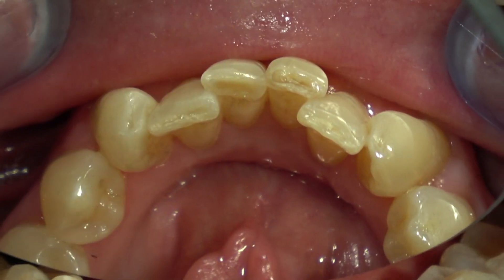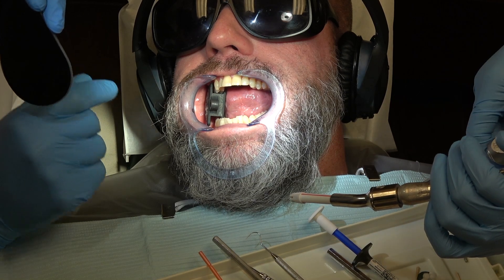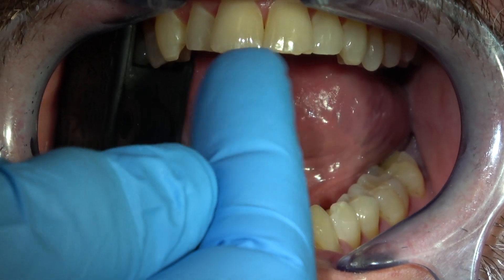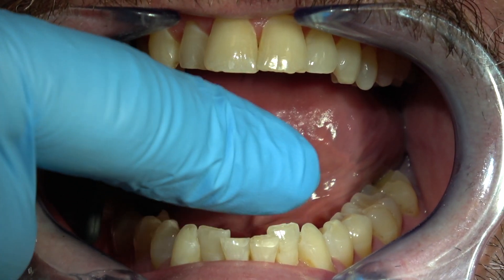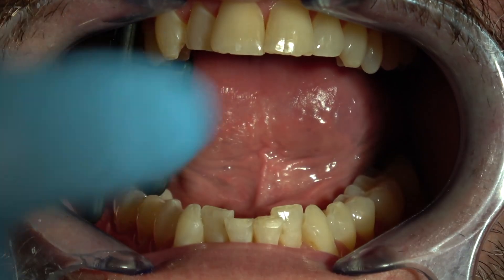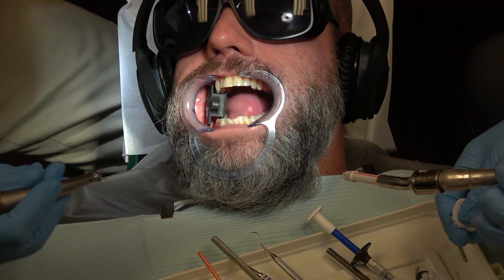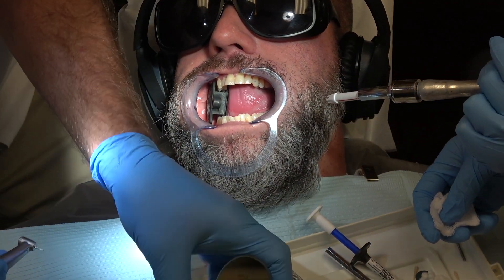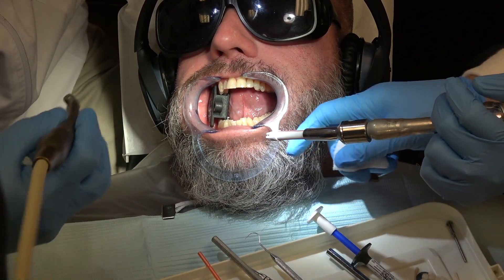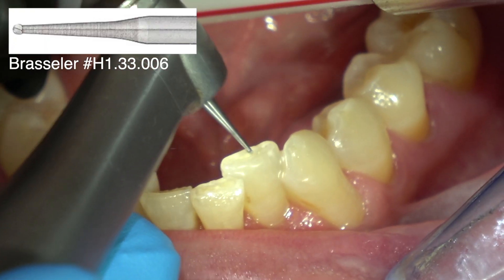Now if you place your composite just on the teeth as they are right now, it wouldn't stay — he'd grind that off. So you've got to make just a tiny little groove in the dentin with a very small round burr. That's a half round burr. You don't have to anesthetize the teeth to do this procedure, but you've got to just very lightly make a little divot or a little tiny foxhole.